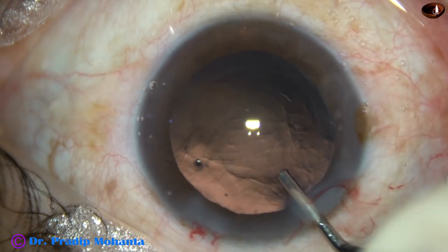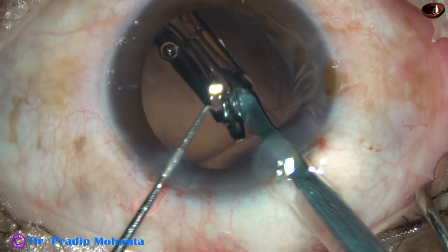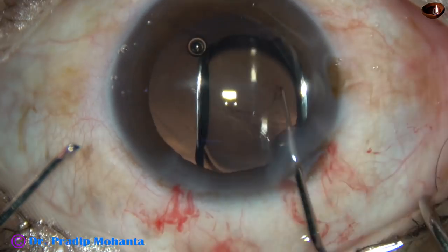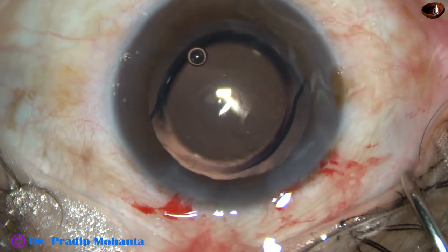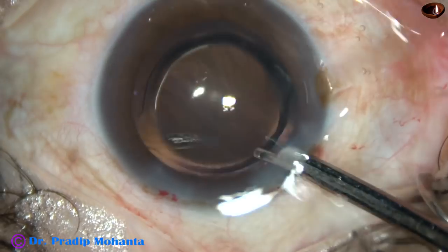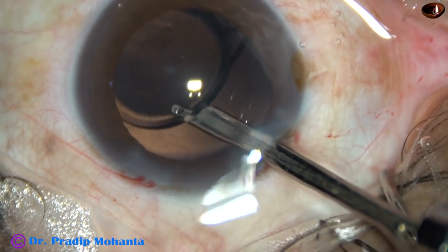And now, the capsular bag and the entire chamber is filled up with 2% HPMC, and then a hydrophobic acrylic single-piece intraocular lens is implanted in the capsular bag. The lens is in the capsular bag and now thorough cleaning of viscoelastic is very much necessary to prevent post-op rise of intraocular pressure.